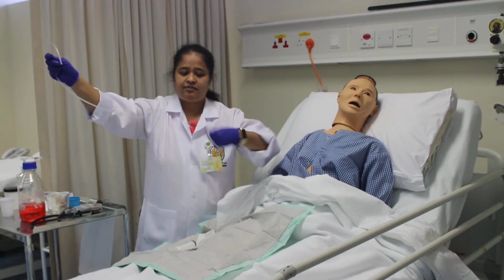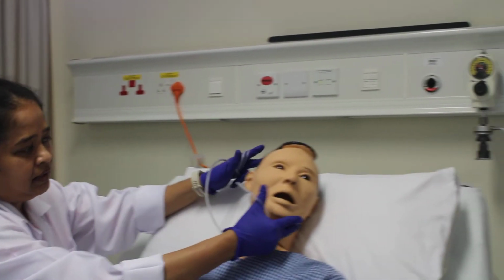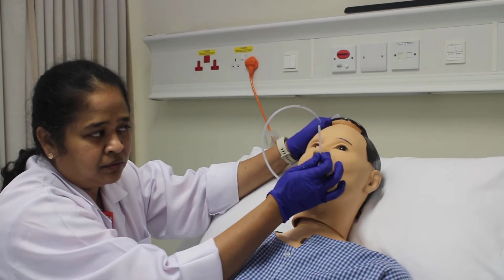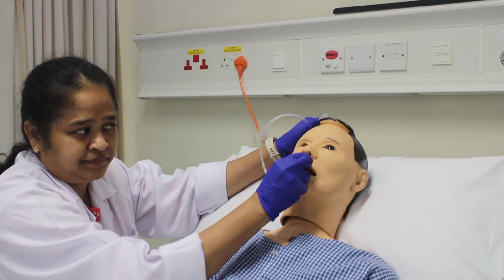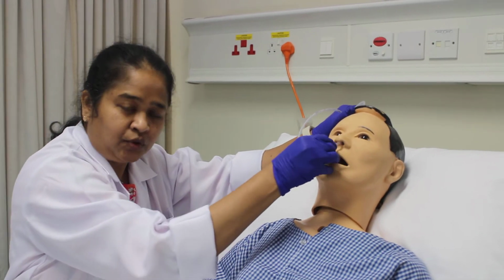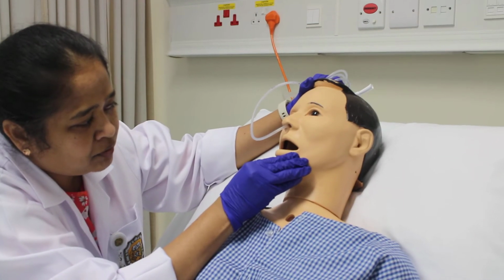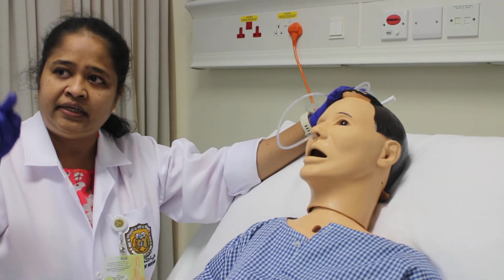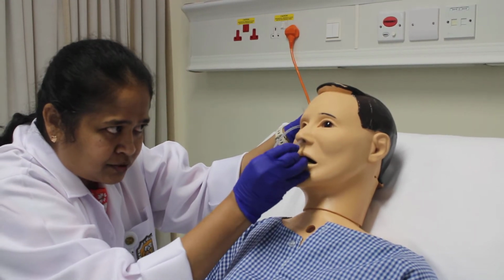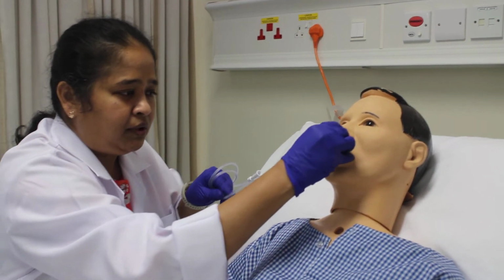Roll the rest of the tube in your hand so that it's not hanging down. First he is hyperextending the neck. I prefer to do it in the left nostril first. As I keep advancing, when it reaches the throat, I can feel some resistance. Sir, can you open your mouth? I should check whether it is coiling inside the throat. It is not. Can you flex your neck and swallow? As he is swallowing, it is very easy for me to go inside.